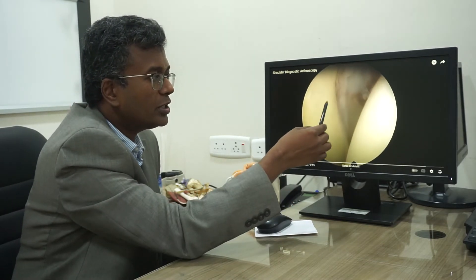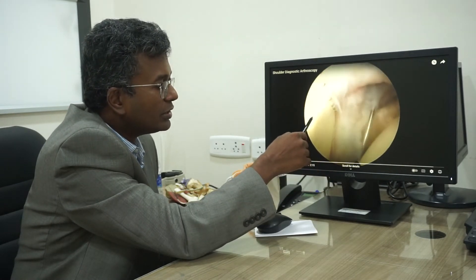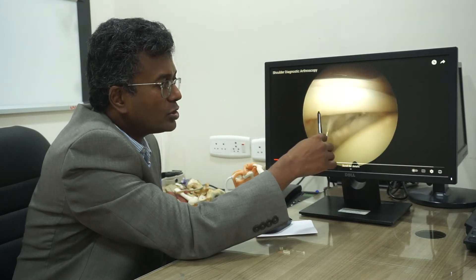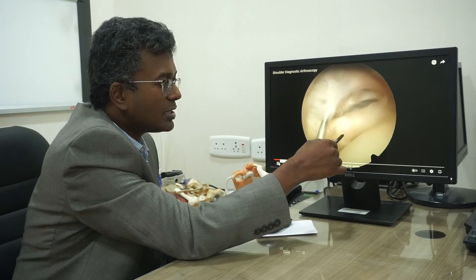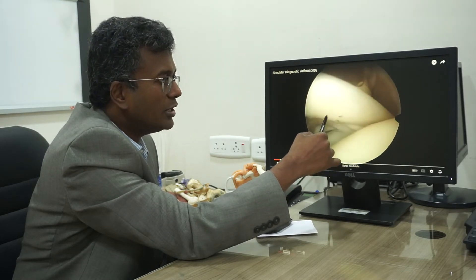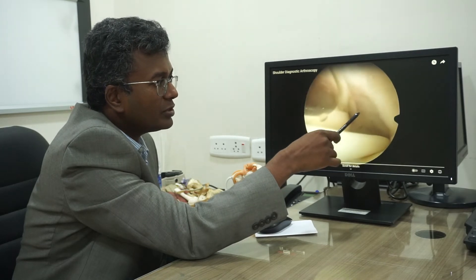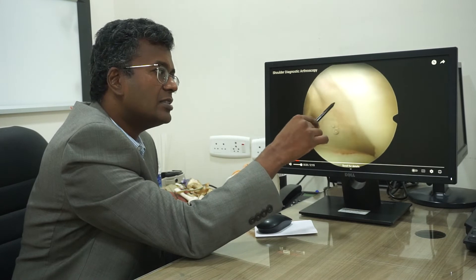This is the glenohumeral joint — here is the humerus and here is the glenoid. This is the biceps tendon, which we call the 'lighthouse' of the shoulder joint. This is the subscapularis tendon, a cuff muscle at the front. This is the capsule, and here is the 'bubble sign,' which means the cuff is intact — the muscles are intact with no fluid escaping through a tear.